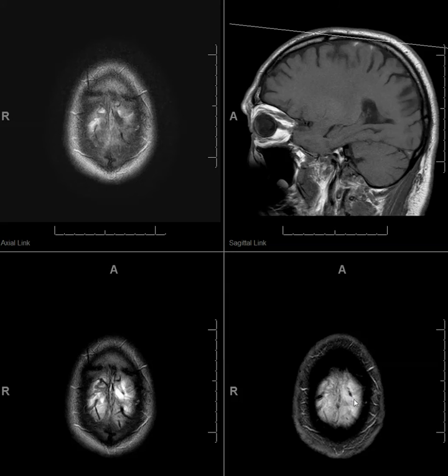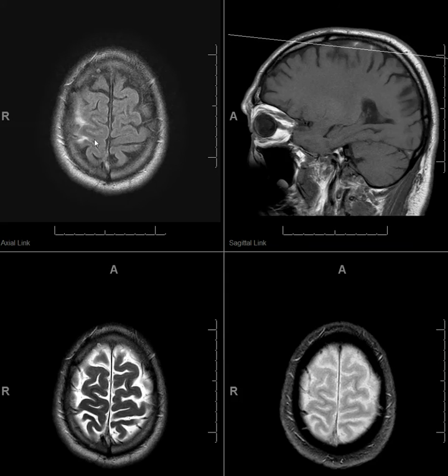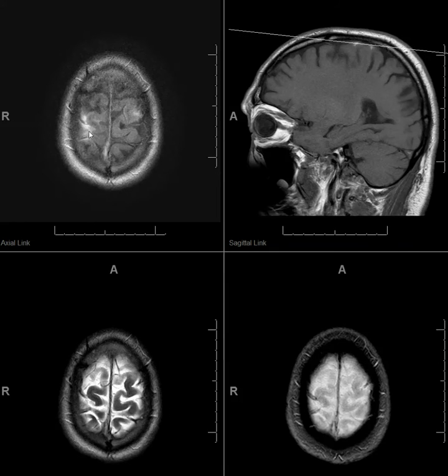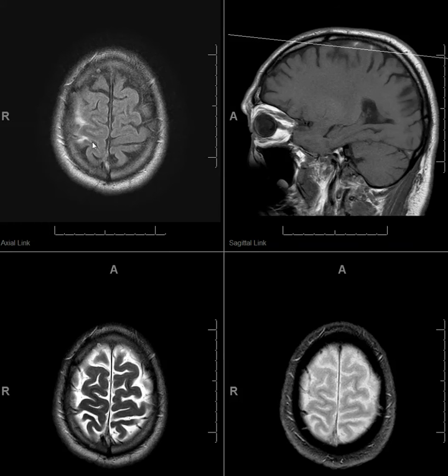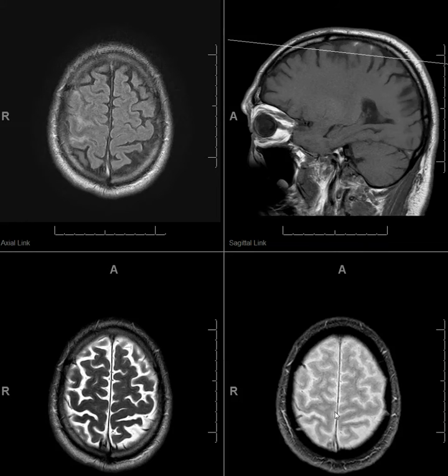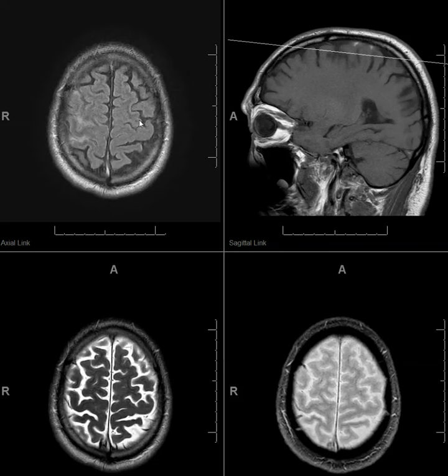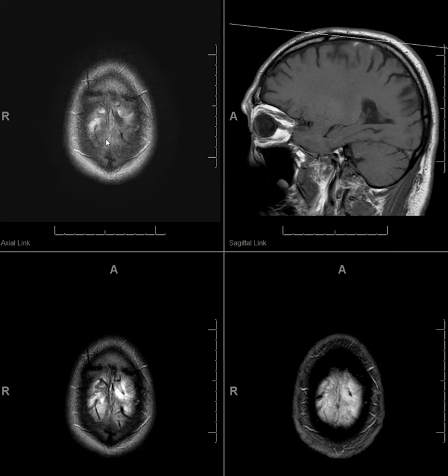On the FLAIR, it almost looks like the vein with some adjacent hemorrhage because they are filling the gap in the sulcal side. However, on GRE, you don't see the subarachnoid hemorrhage — so that is the appearance of cortical vein thrombosis, bilaterally.